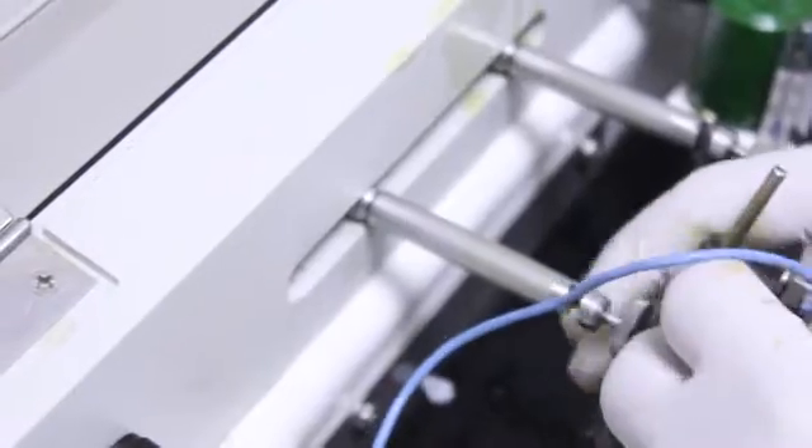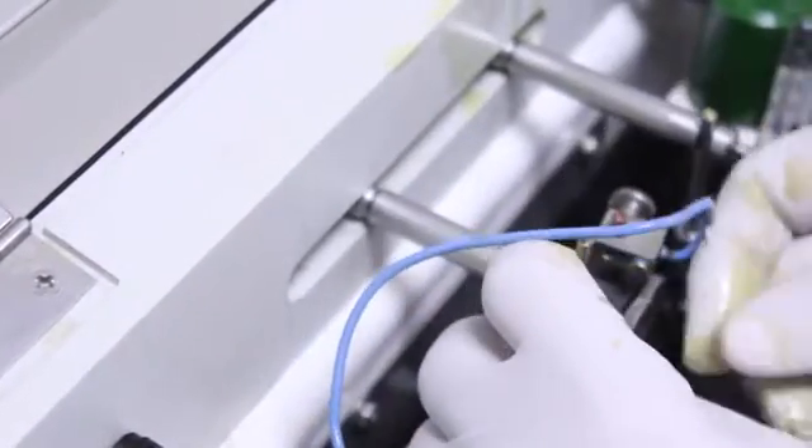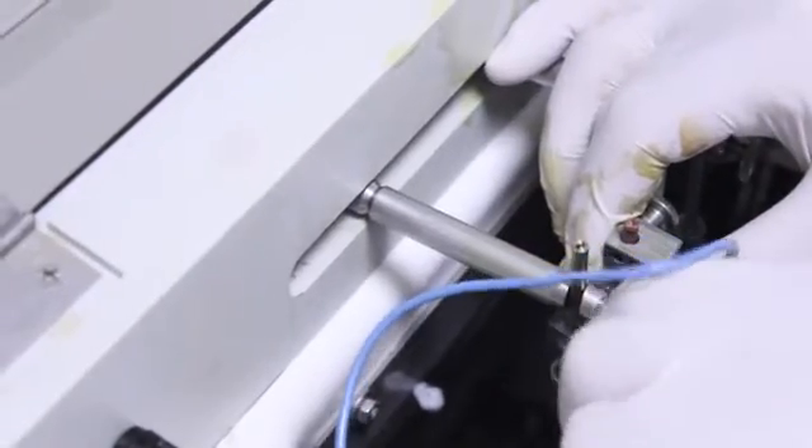Electropolishing is then carried out. In this procedure, atoms of metal from rough projections on the metal framework go into solution before those in smooth areas do. This results in a very consistent, satin-like surface. The polishing occurs in a bath of 85% orthophosphoric acid, which is heated to 49°C to 60°C.